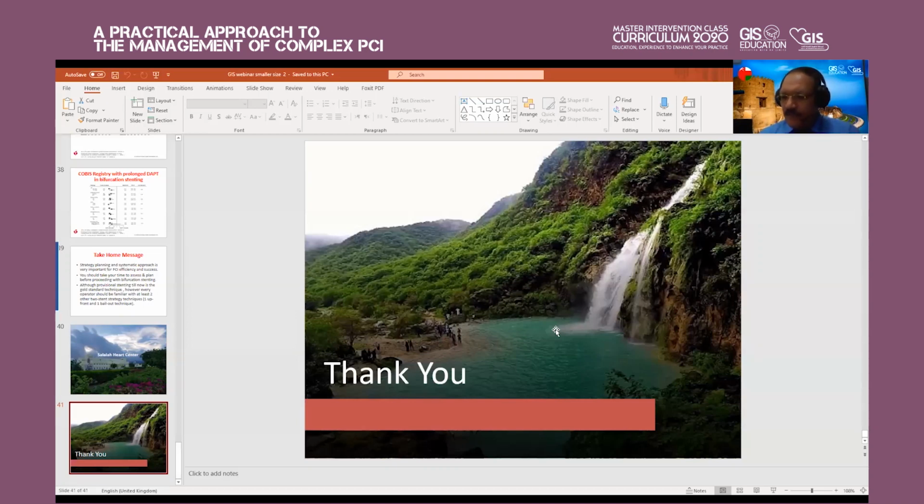And you are good that you noticed the loss of this diagonal artery. Also, you can see there is another clue: the LAD is not showing any branches, and this area is clean. The diagonal area is clean from arteries.